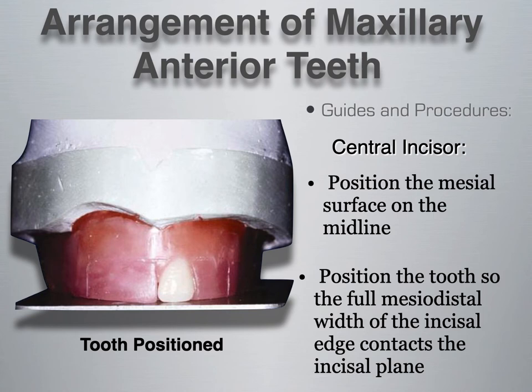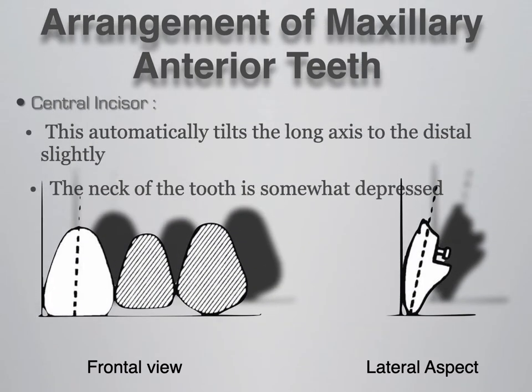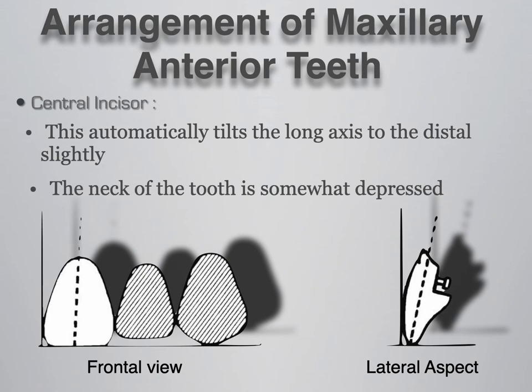Although the tooth has a distal inclination, the incisal edge is parallel to the occlusal plane. By tilting the incisors with a distal inclination the way they should be set, your incisors should all be parallel to the occlusal plane. If we look more closely at the central incisor, setting the incisal edge directly on the plane automatically tilts the long axis distally. There should also be noted that the neck of the tooth is somewhat depressed into the wax, giving a slight anterior flare from a lateral aspect.